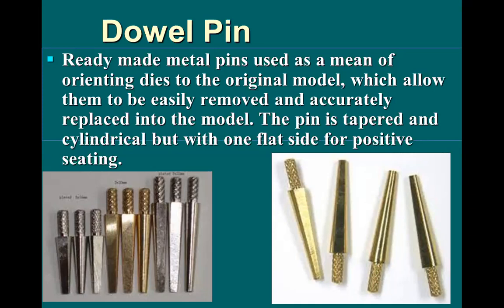It is a general design of a tapered pin, cylindrical in cross section, but this circular cross section has a flat side for positive seating and to prevent the complete rotation of the dowel pin in its place, for perfect and positive seating of the die in the cast.